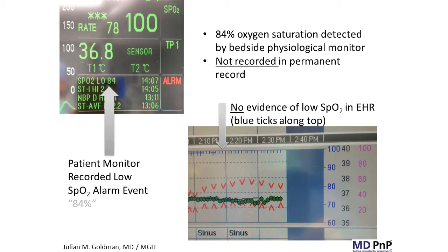These quick early desaturations on a patient are usually indications that something's going wrong, that there's a problem with the patient, sometimes hours before the patient has cardiac arrest or respiratory depression. But they're missed because there isn't a clinician sitting at the bedside looking at every single value. They're looking at the medical record. They're looking at the trend screen. They don't ever see these. They disappear.